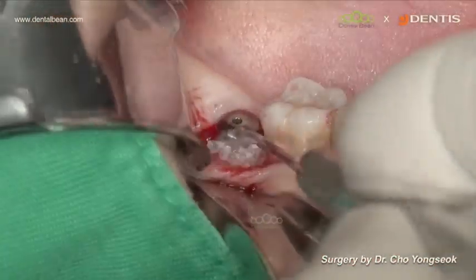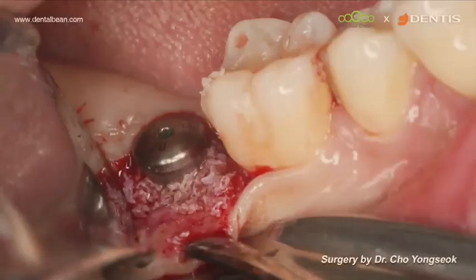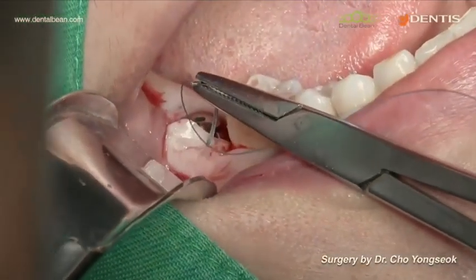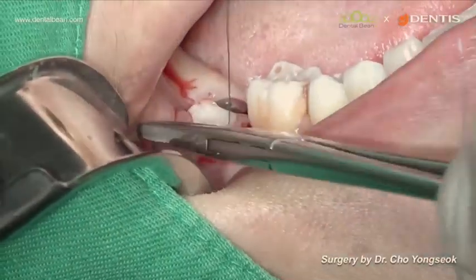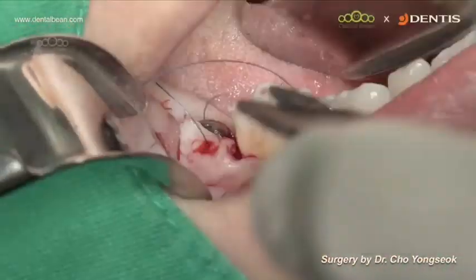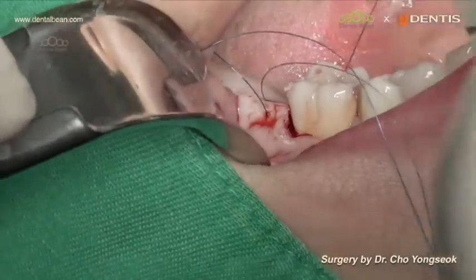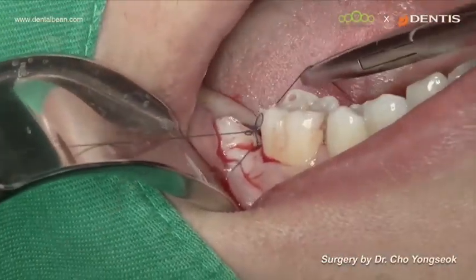Okay, maybe it is not necessary to graft the bone in such a situation. You can omit it, but to increase the volume, I simply grafted the bone without a membrane. And here is the technique of the modified external vertical mattress suture to make an apically positioned flap.